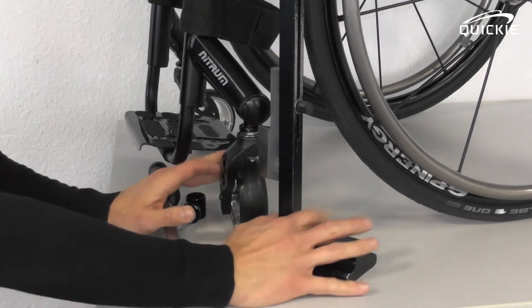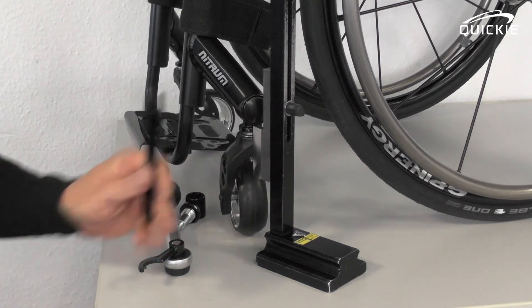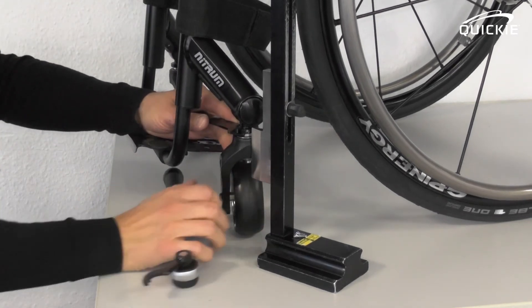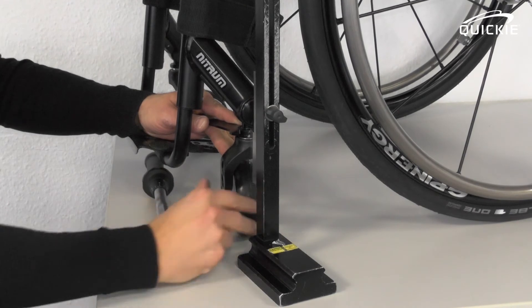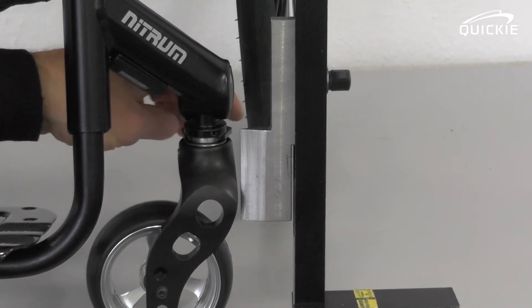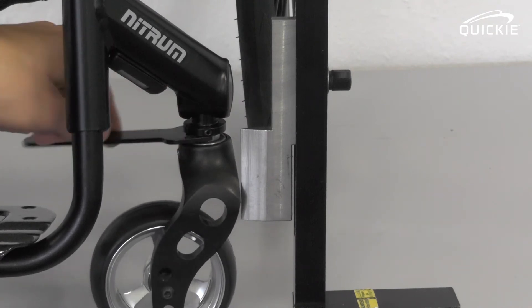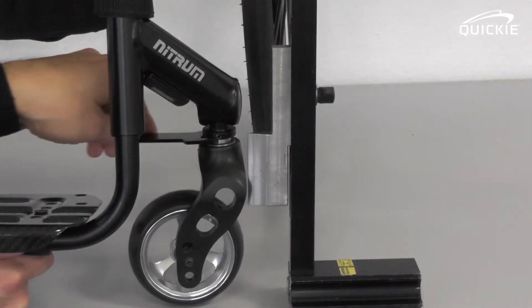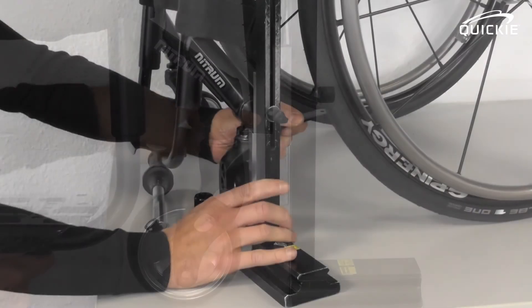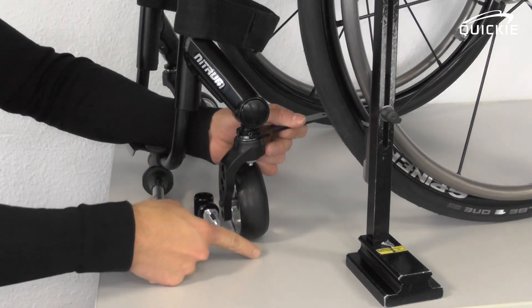Hold the gauge against the flat spot and you will probably find that it doesn't align. Use the spanner, insert it, and turn it by a maximum of 90 degrees. You will see the caster fork moving to the sides. Adjust it so that it exactly aligns with the 90-degree gauge, meaning that this plane has a 90-degree angle to the floor.